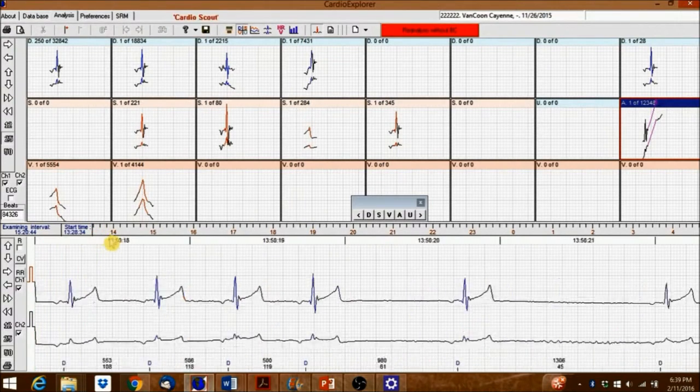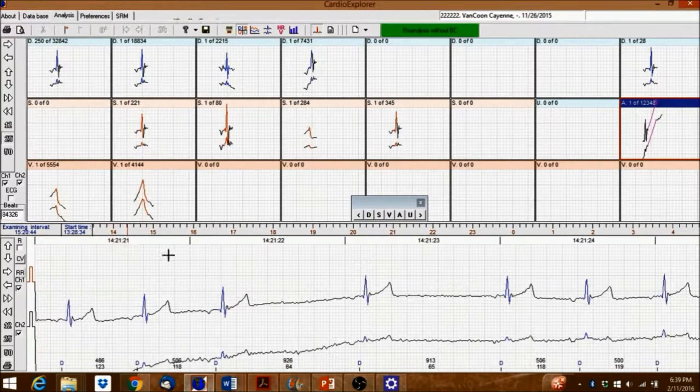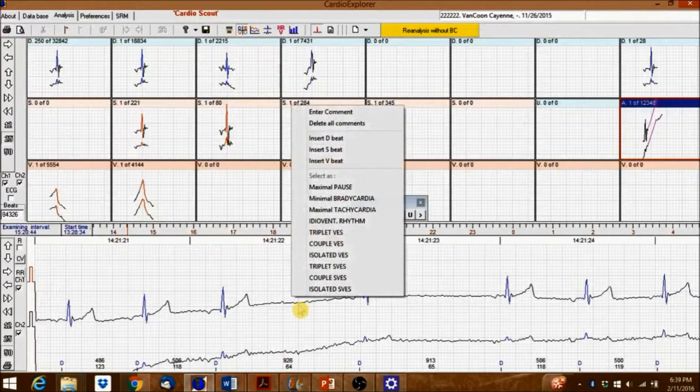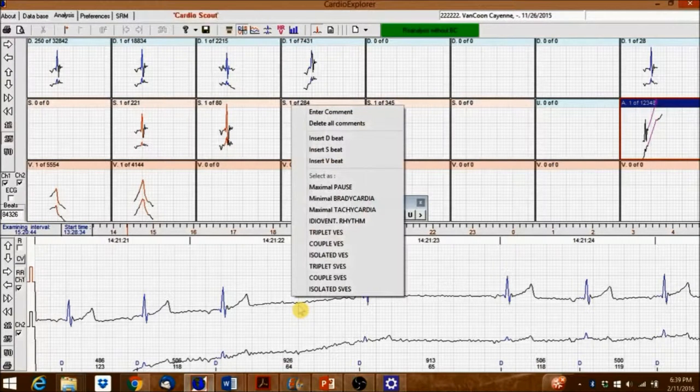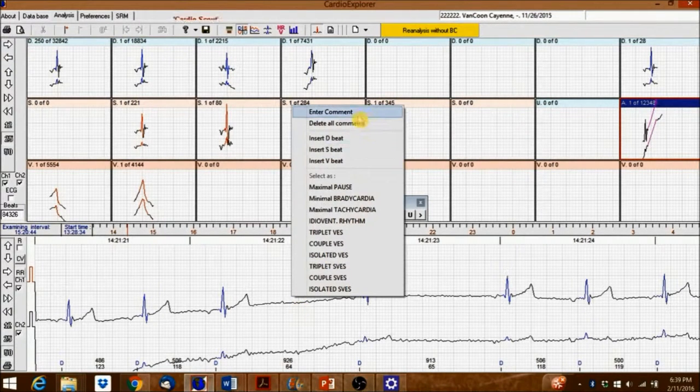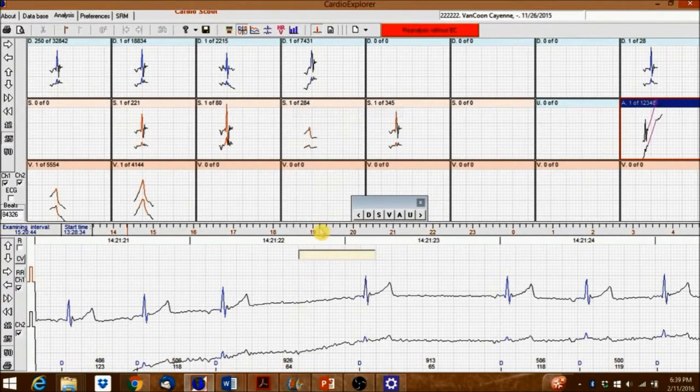In the signal window, right-clicking in between beats will open a menu selection. Click on Enter Comment to add a comment.